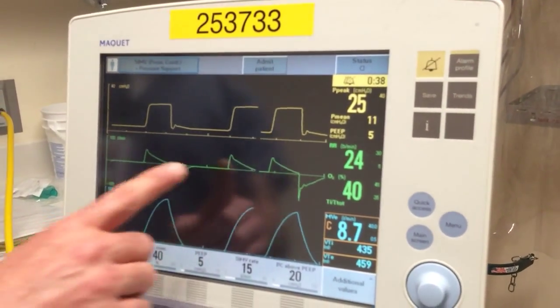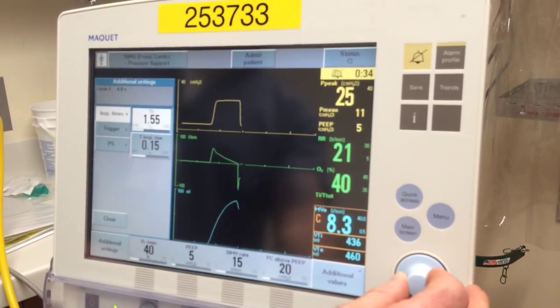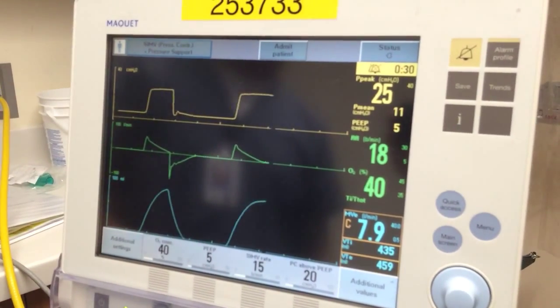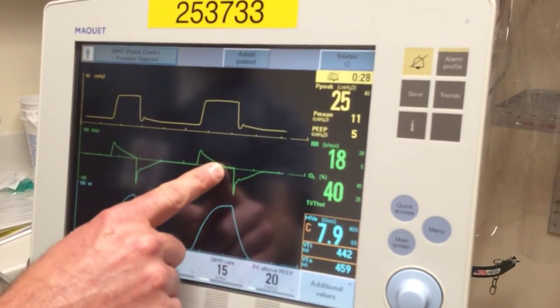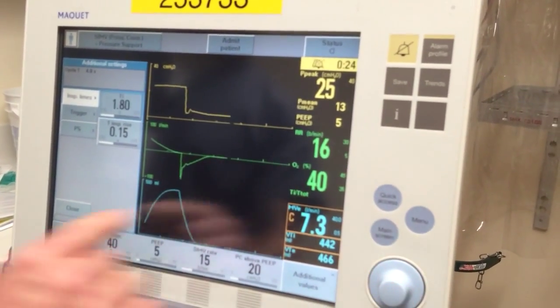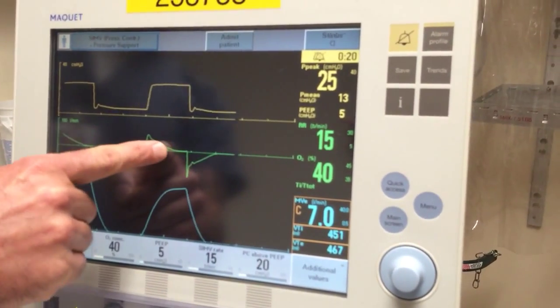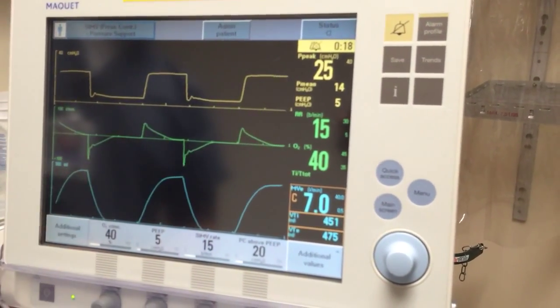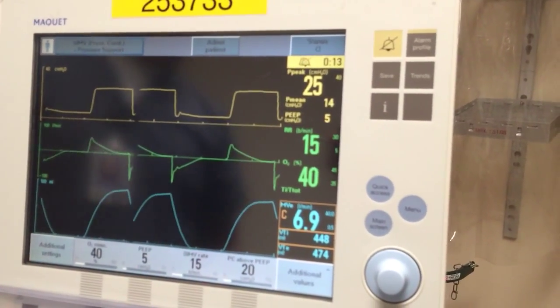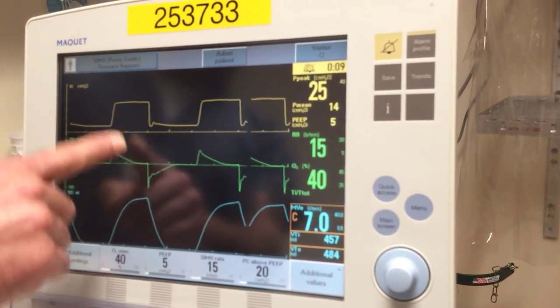The third factor is a hold. An inspiratory hold can be achieved by setting your I time longer than what is physiologically necessary to expand the lung at the ordered pressure. This is seen by a flat spot on your flow curve. It's telling you basically that at the 1.2 seconds that I had set prior, the lung is fully expanded to the pressure that's ordered, yet your I time is longer than that time frame takes to happen, so I'm just going to hold the pressure.